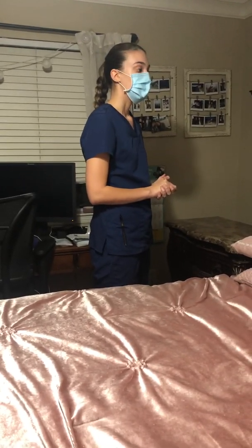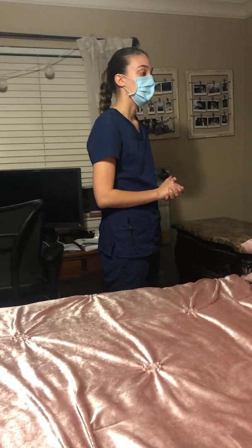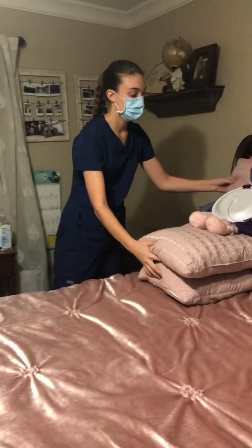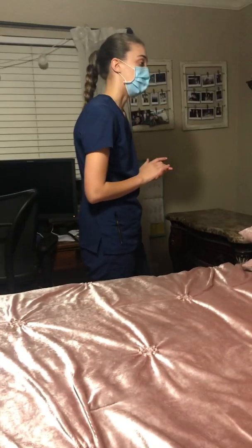So I see on your chart that you had this changed 7 days ago. Do you recall that? Yes? Do you have any concerns or questions? No? Awesome. Are you experiencing any pain or discomfort? No? Okay. I'm going to go ahead and help you get into a comfortable position. Alrighty, let me know if you have any pain or questions at all throughout this.